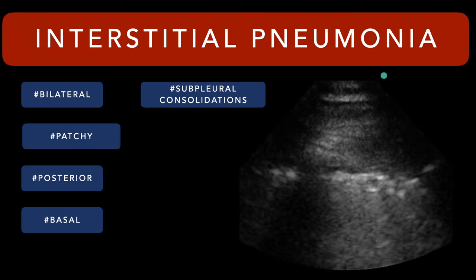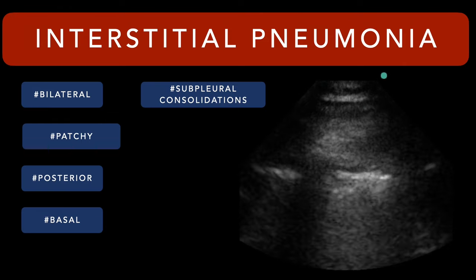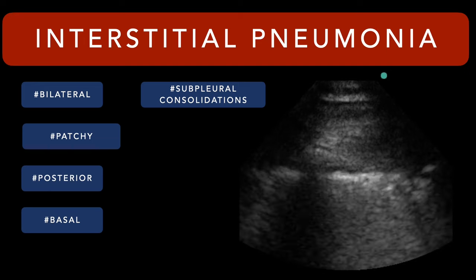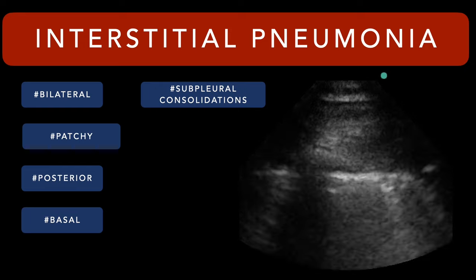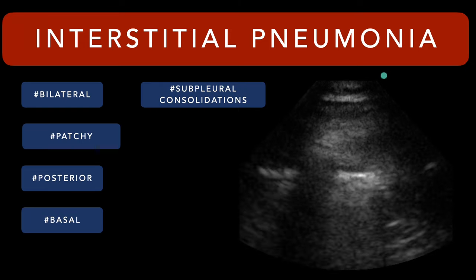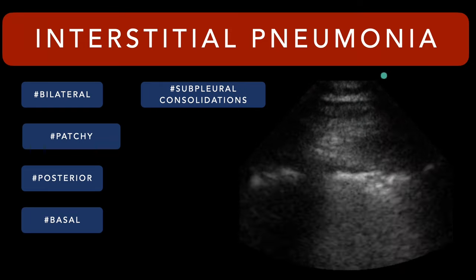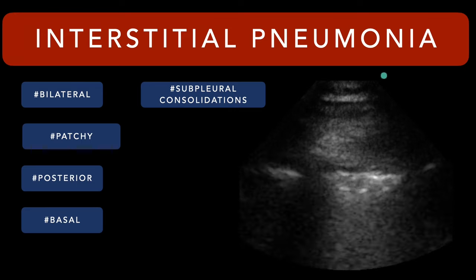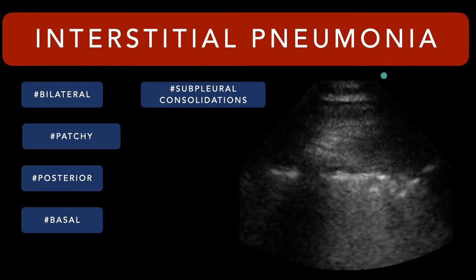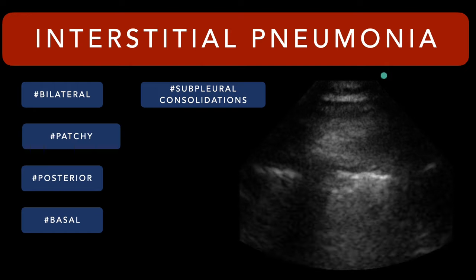And so the studies were showing in 2020, like, hey, look, a lot of these things are going to be seen mostly in those posterior lung fields, right? In the posterior basal lung fields. And the other thing that was described in this situation, there's a little nuance in these subpleural consolidations, which you can see in this image as that lung goes back and forth and kind of hides behind ribs between breaths here. But it's that area where the pleural line is not smooth, right?